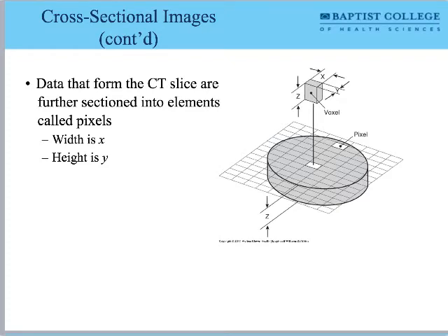Because I'm constantly having to remember, okay, yeah, that's the liver, but it's on the other side of the picture from what I would expect. You're constantly reminding yourself, oh, that's the patient's right side, that's the patient's left side. We're normally pretty good with the y-axis. Moving up and down on the y-axis, anterior to posterior, that's pretty obvious. With the left to right thing, I see students get tripped up.